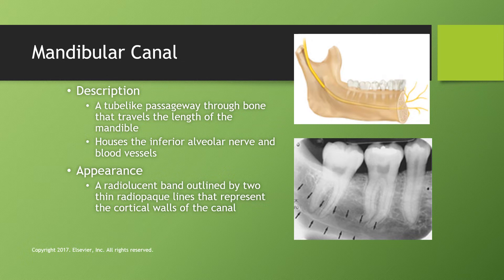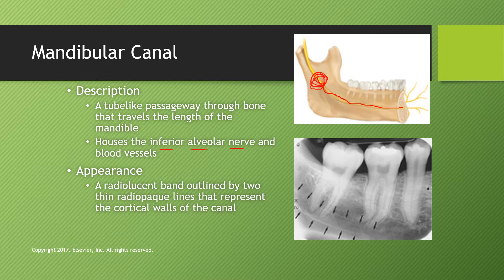The mandibular canal is a tube-like passageway through bone that travels the length of the mandible, starting back at the ramus and traveling underneath the alveolar ridge to supply all the blood and nerve endings that the mandibular teeth need. It houses the inferior alveolar nerve (IA). The appearance is a radiolucent band outlined by two thin radiopaque lines representing the cortical walls — you will always see these two thin white lines bordering the mandibular canal.